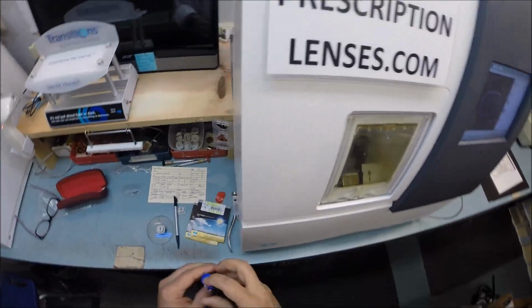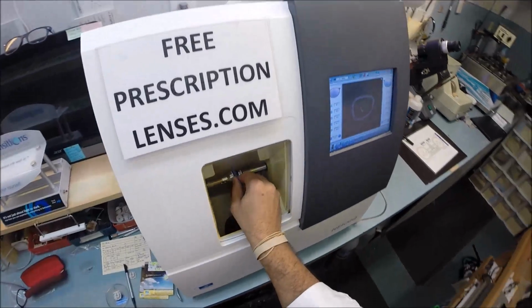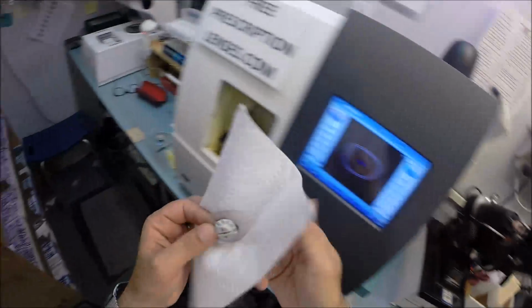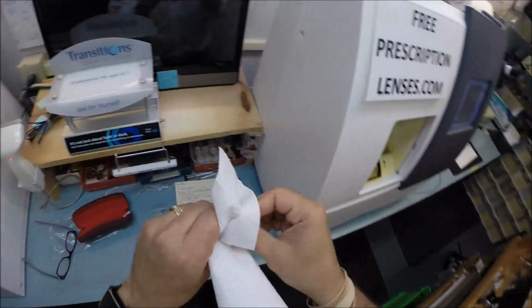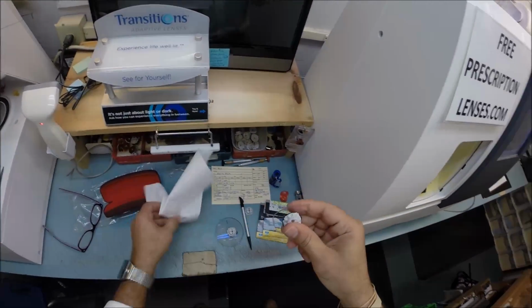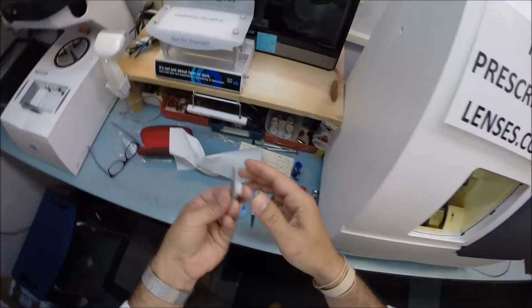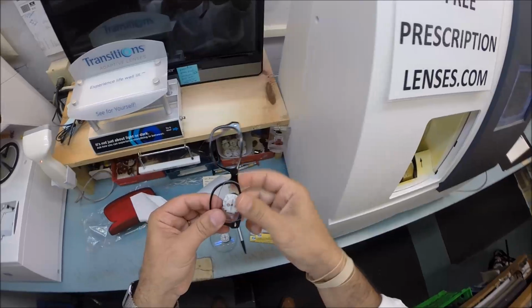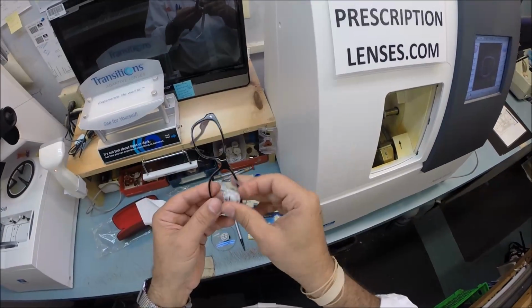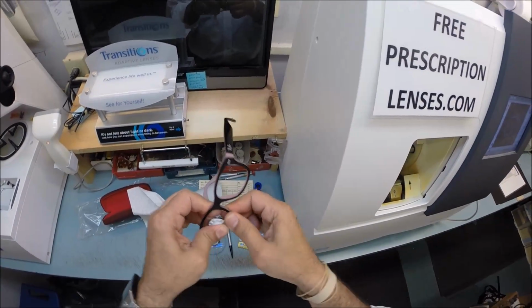So the door will open. I will hit this button, taking your lens out. Let's dry everything off. It's just come out of the bath. It's clean and April fresh, even though this is May. May fresh is even fresher than April fresh. All right, so let's see if the lens fits this time. Something's wrong. It doesn't fit. Let's see. Let's try this side. Hey, wait. I think this works.